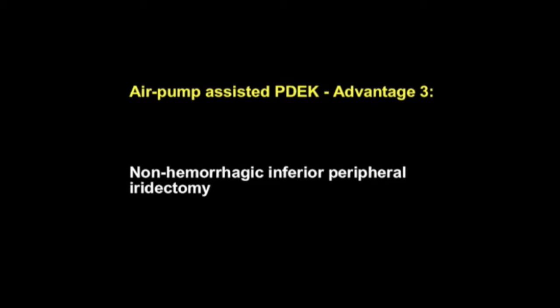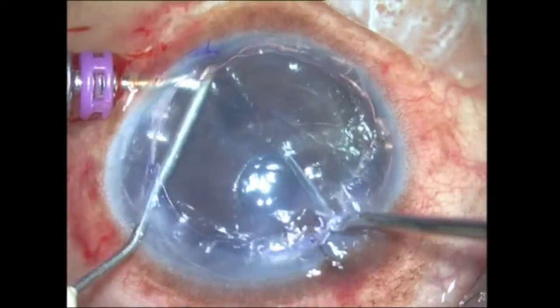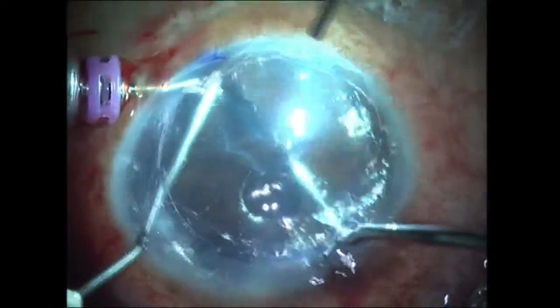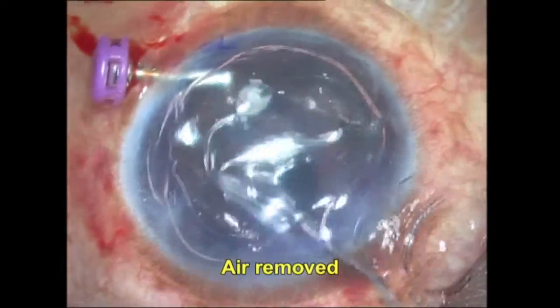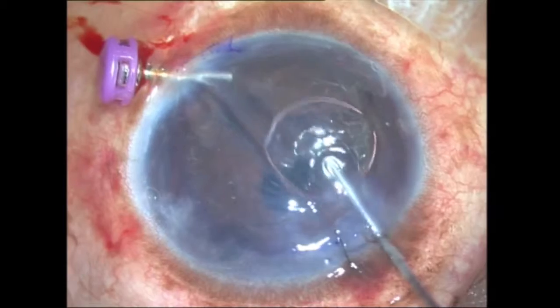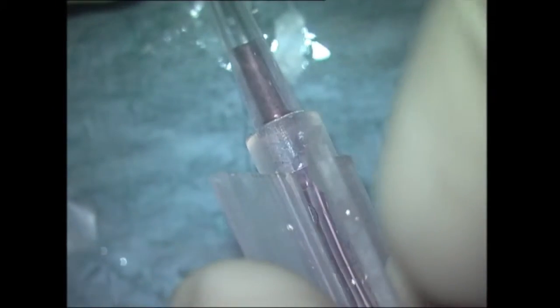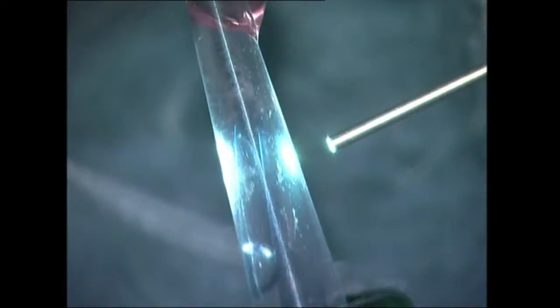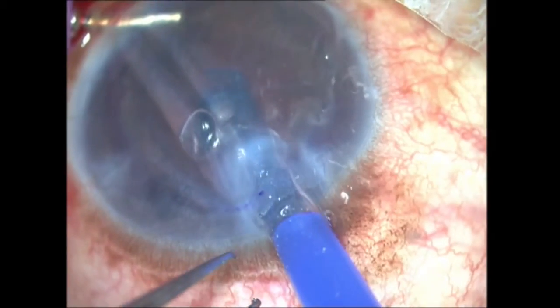The second important step now is to do a peripheral iridectomy, and this is again important because it allows you to do this without bleeding in the anterior chamber. Many of these patients have a lot of peripheral neovascularization, and sometimes blood seeps into the anterior chamber through that, but when you have this continuous air insufflation going, it prevents all that blood going into the anterior chamber. This is another technique of mine which I call EDMEK, or endoilluminator-assisted DMEK, and I think we've talked about this in one of our previous shows.